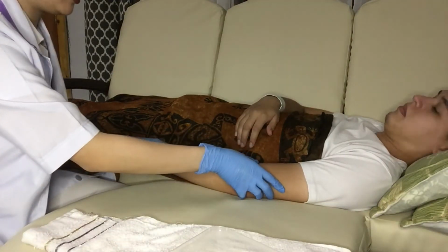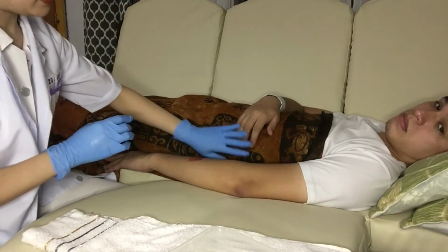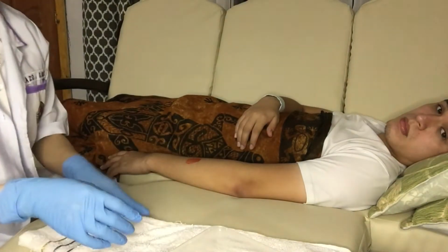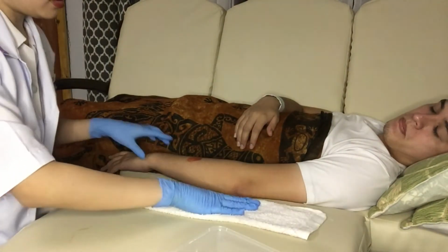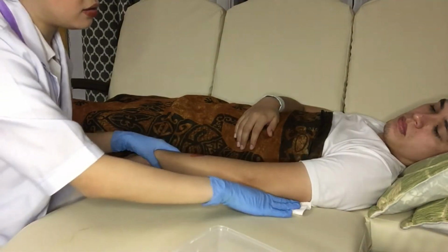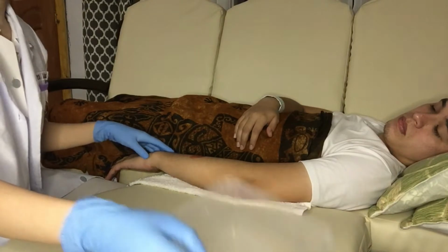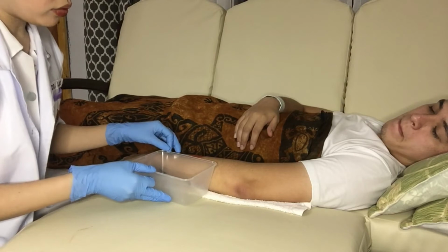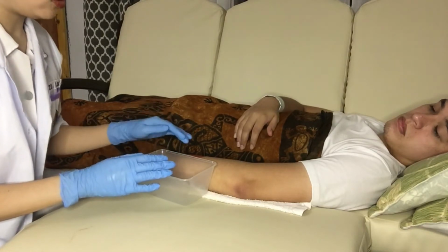So sir, position na ato ang kamot. Then dapat kanila ang naka-expose, then ang lawas nakatabon. Then i-insert na ko ni sa ilalom para dili mabasa imong bed inig irrigation nato. Then kani ang kidney basin, butang nato siya sa kilid sa imong kamot para mao ni ang mosalod sa solution or liquid. Next, attach a 19 gauge angiocatheter. This is to provide proper amount of pressure during the irrigation.